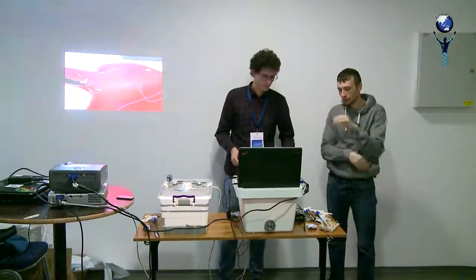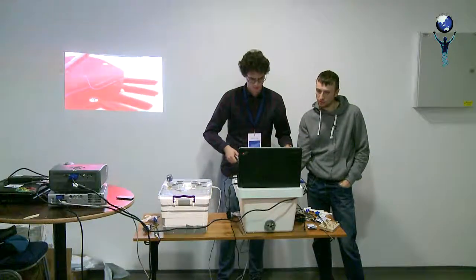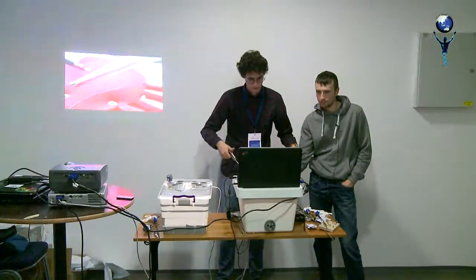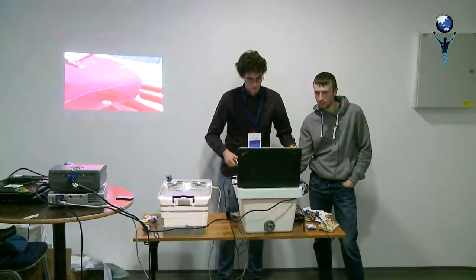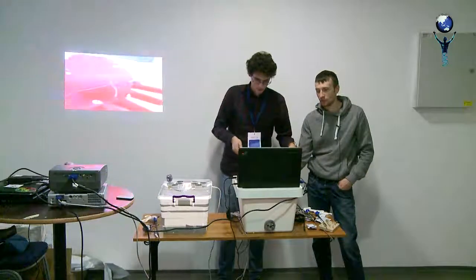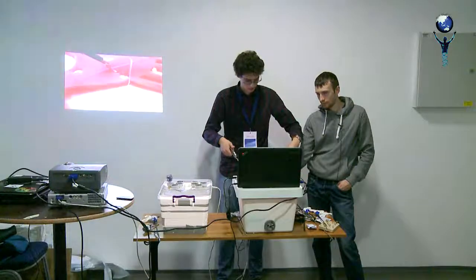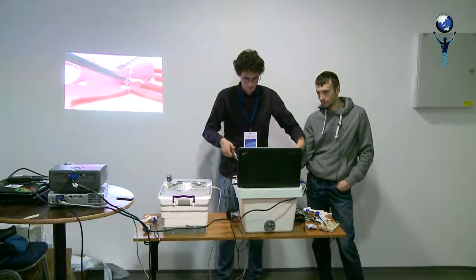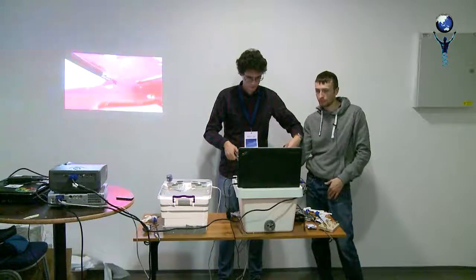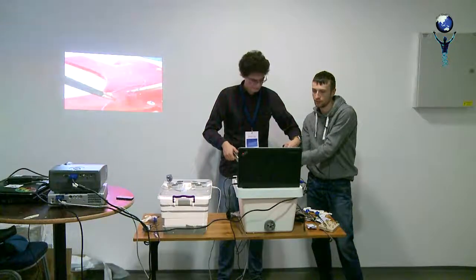So first of all, when you try to make an over and under wrap, you need to catch the end of the wrap with the left hand. So I'll show you. You need to grab it at the very end. So there is the very end. No, with the left. If you're a left-handed surgeon, with the right hand. But if you're a right-handed surgeon, exactly. Now you can rotate the arm of the left instrument with the index finger in another way. Okay. In the right turn. It can be screwed.